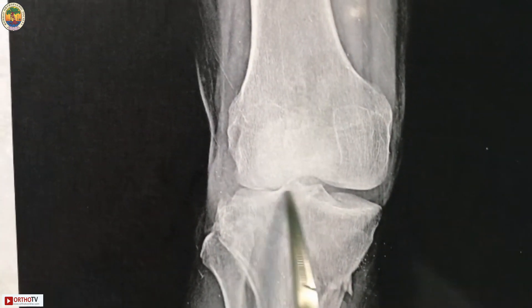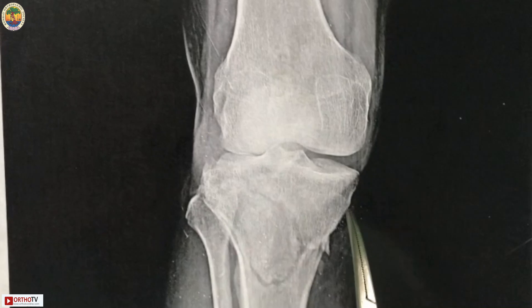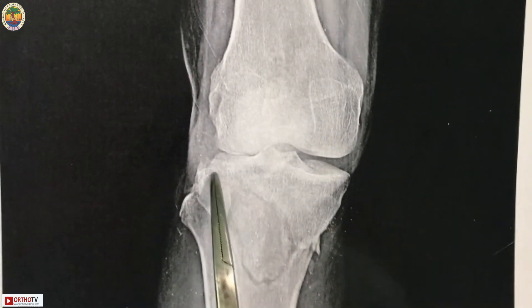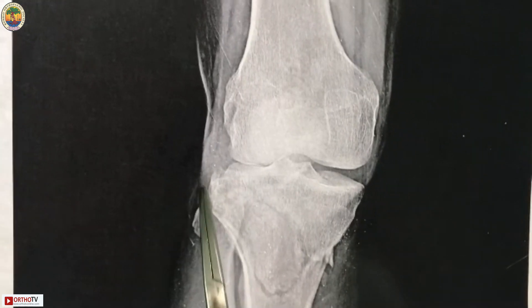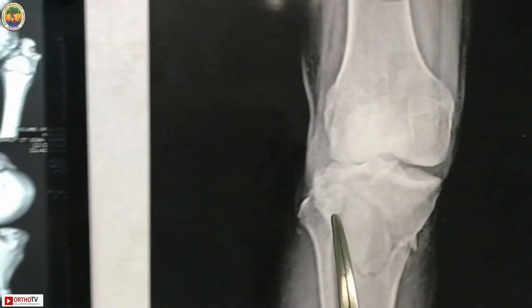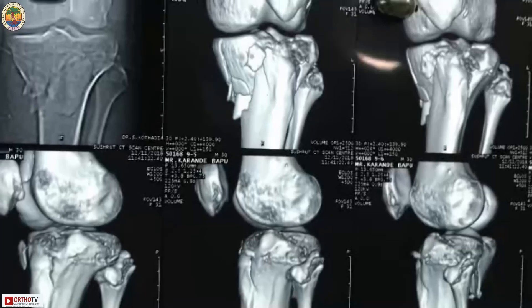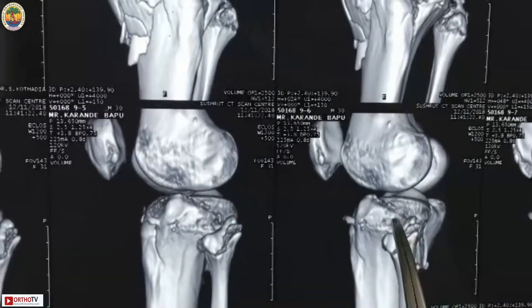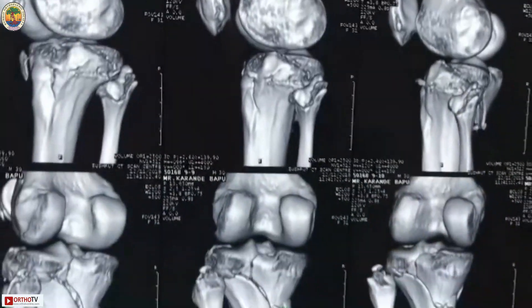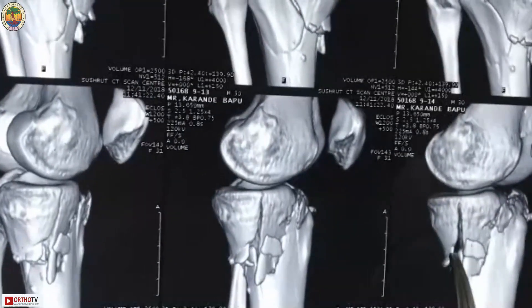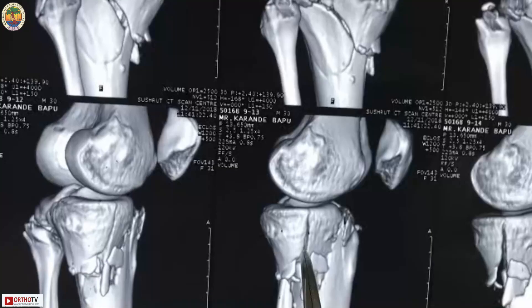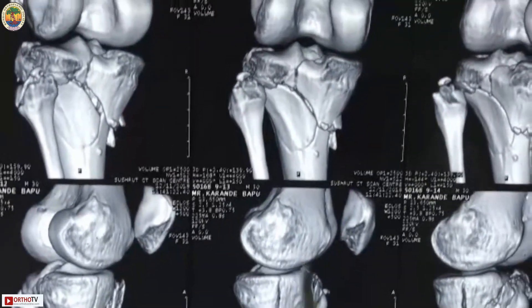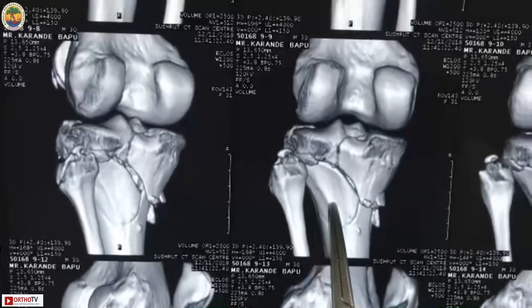This is a case of bicondylar fracture where you can see the medial condyle is fractured and the lateral condyle of the tibia is also fractured. On 3D CT, there is a lateral condyle fracture which is depressed, and a medial condyle fracture which is split in a coronal plane.